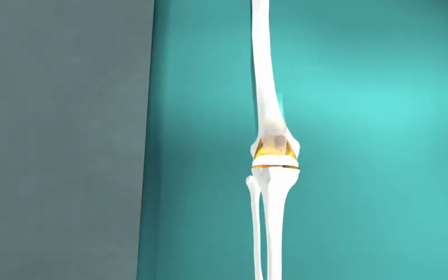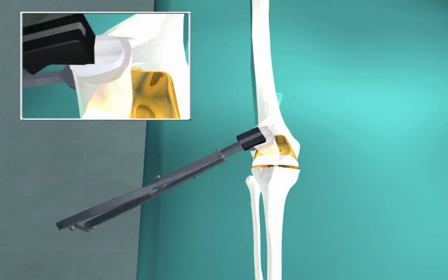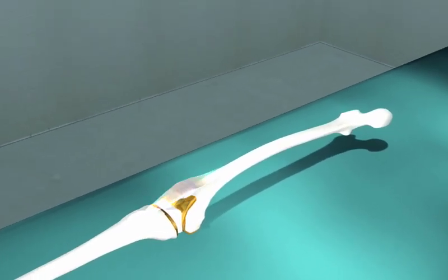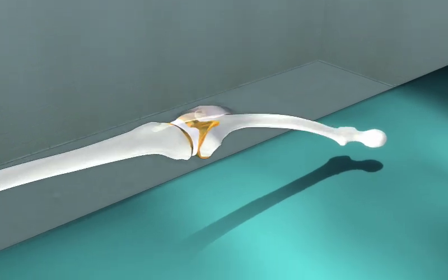The patella is then cemented into place into the 3 lug holes previously prepared, and the patella clamp can be used to squeeze it in position and hold the patella while excess cement is removed. Now that all components have been completely installed, they are checked for range of motion, and any impinging tissues should be removed at this time.